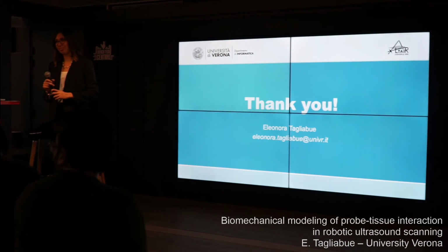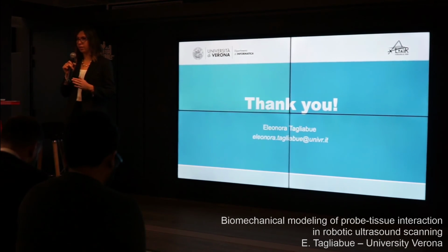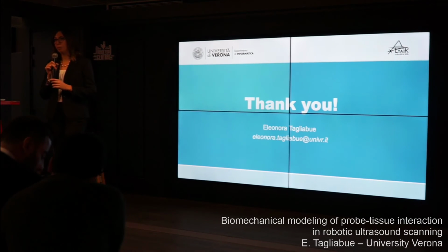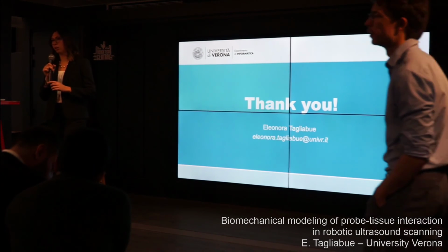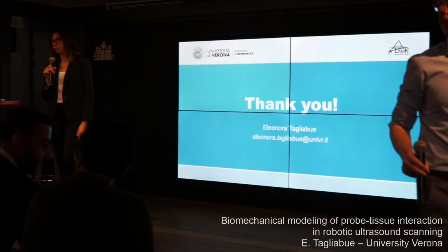My question is about modeling of the breast tissue. How many different material characteristics did you take into account? Did you model the skin in a different way than the inner tissue? No, so actually we were modeling just the breast as a homogeneous object, but not using a linear elastic law, but a hyperelastic law, which made the modeling of the contact even more challenging. But no, at this stage we were not taking into account any heterogeneities and not the presence of multiple materials.